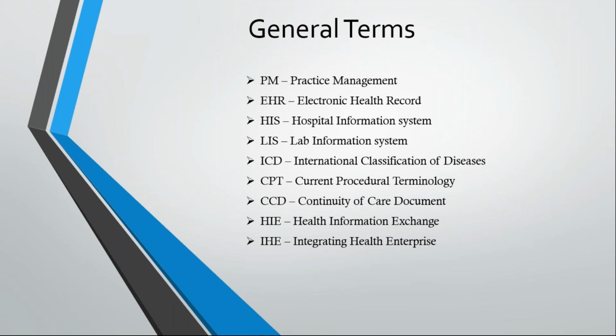All of that clinical information, electronic health record module. So this is also another software application used by the doctors. Next, hospital information system. So all of these things put together, whatever falls under whatever software we use within the hospital, billing system or PM system or EHR system, all of these put together are called as hospital information system.